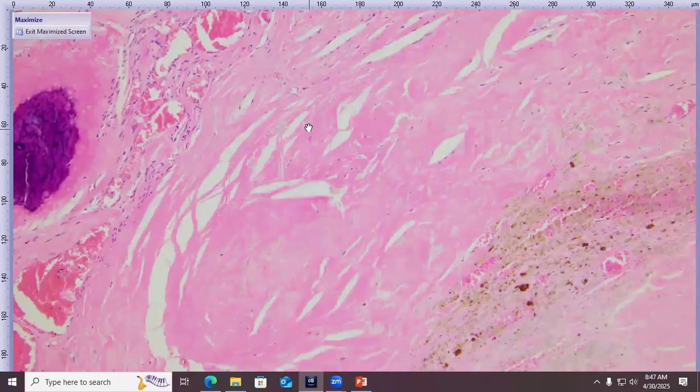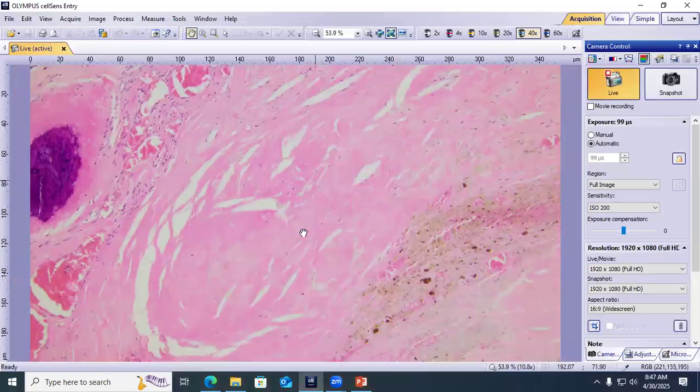This is sporadically reported in various breeds. It's usually unilateral. There are a couple breeds, the Doberman Pinscher and the Staffordshire Bull Terriers, where it's a hereditary pleomorphic condition, and it's bilateral in those breeds. And I think that was all the findings for this case.